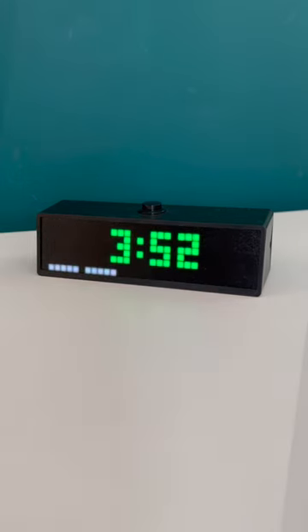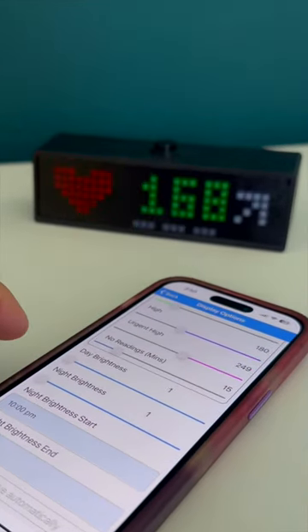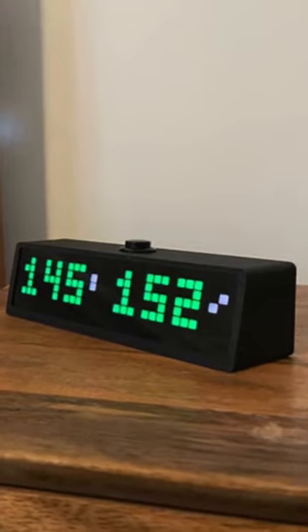On the app, you can switch between displays, set brightness for the day and at night, and even display two people's sugar readings at one time.